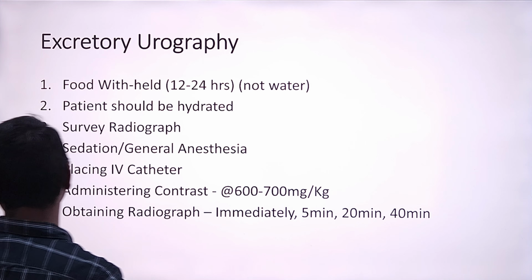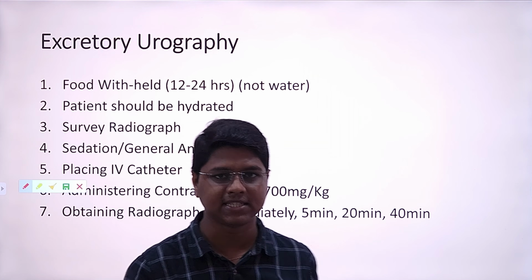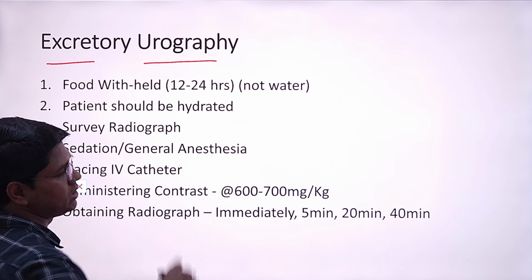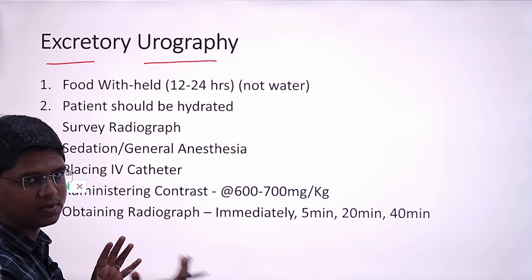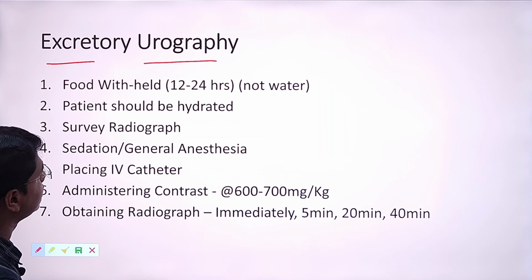Now let us go to the technique through which kidneys are evaluated mostly. It is excretory urography, in which you will be administering some contrast agents to give a good contrast, so that you can visualize the kidneys better. So there is a procedure for this excretory urography.